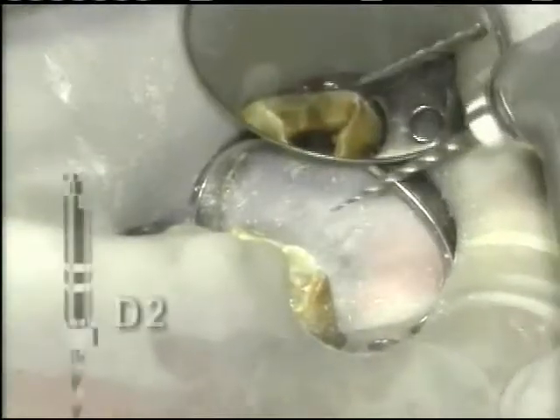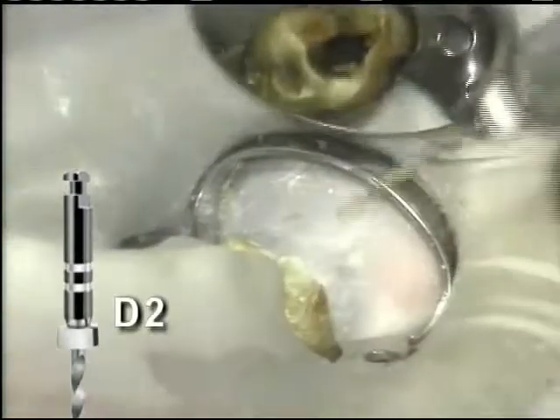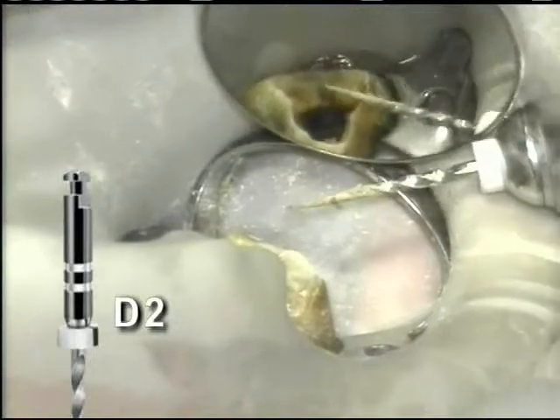The D2 is used next to progressively work the middle third. The removal, inspection and cleaning steps are included here, too.